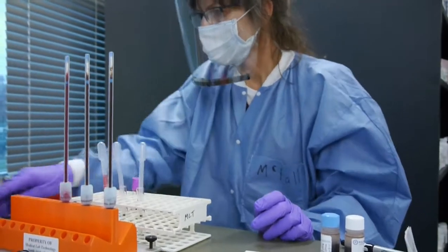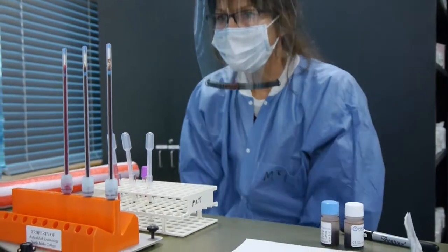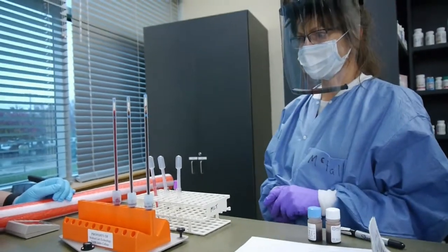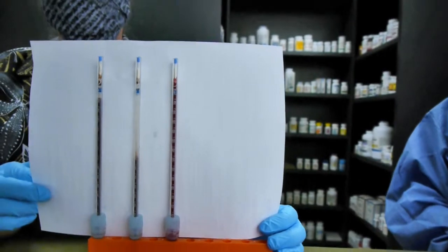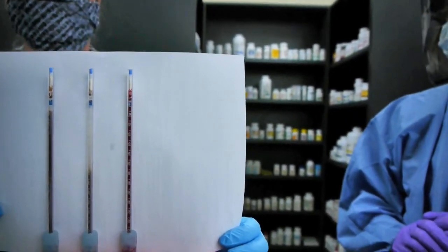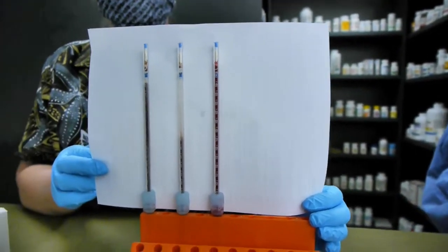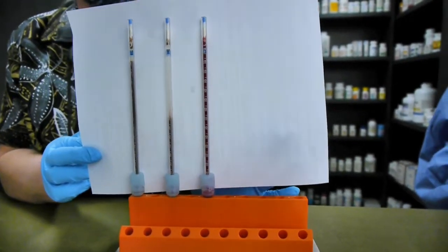This device sits on a leveler, so you want to be sure the bubble is in the middle, confirming it's completely level. Then set the timer for one hour. It's very important to keep your timer handy — typically in your pocket — because you'll be doing other tasks during that hour. As soon as it beeps, you have to respond and read it, because results can change quickly.